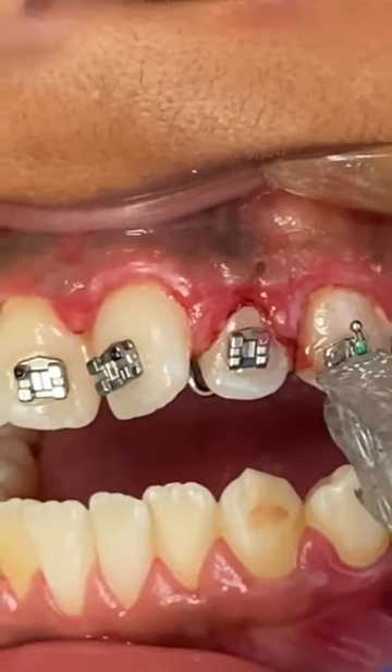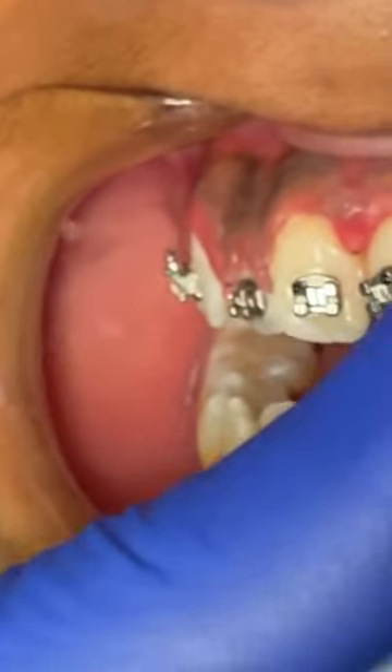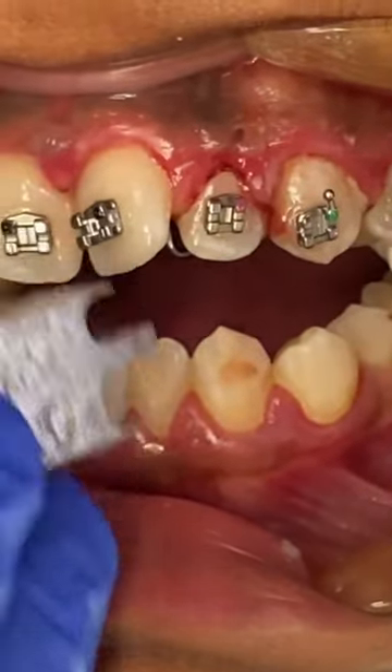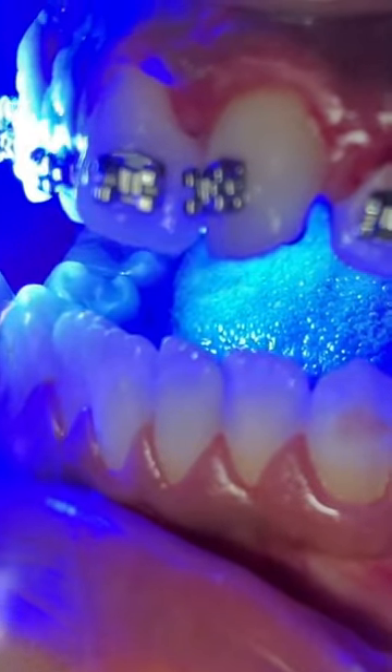We went ahead and put this appliance here to prevent any further tongue thrusting. As you can see, his gingiva was very inflamed, so we went ahead and cleaned it up a little bit and put his brackets on to start his alignment on the top. Due to his bite, we're only going to put braces on top, and then later on we'll put them on the bottom.